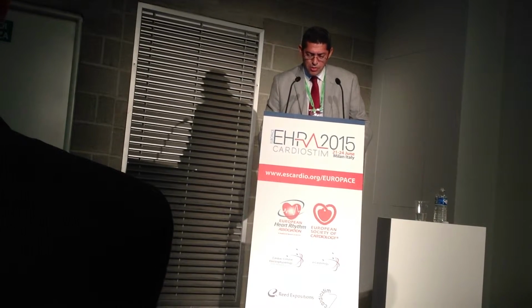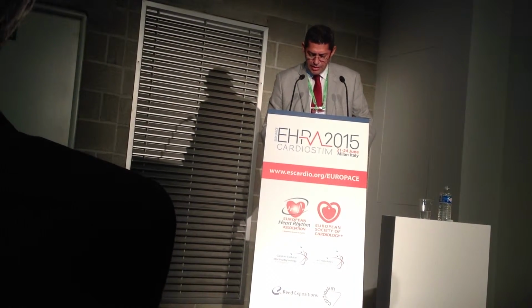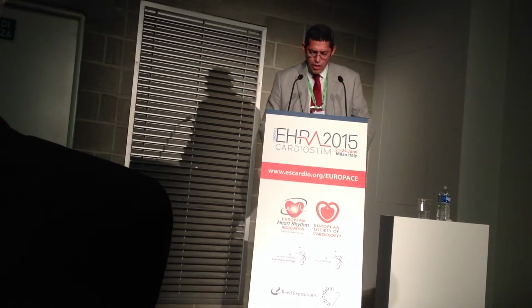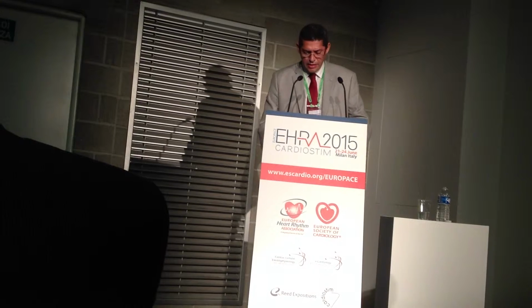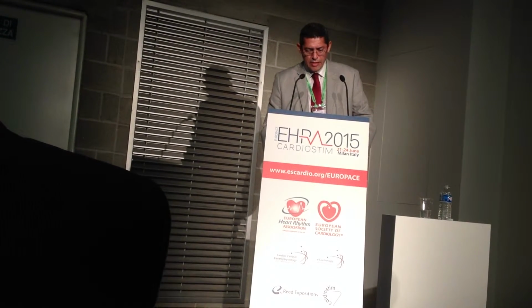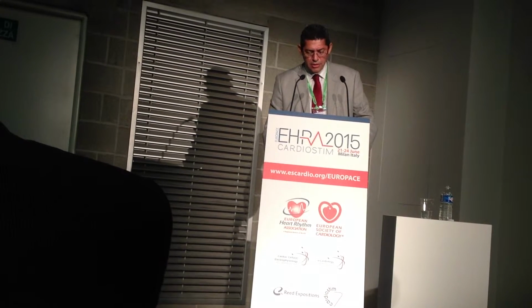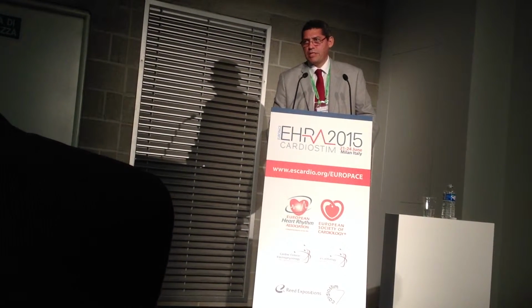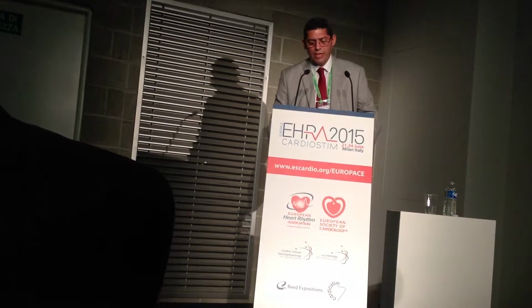The radioscopy shows ablation catheter in the right side and ablation catheter in the left side. Or mapping in the coronary sinus, as you can see here in this image, early activation in the distal coronary sinus that suggests a left origin. In this case, the arrhythmia origin was in the left coronary cusp.